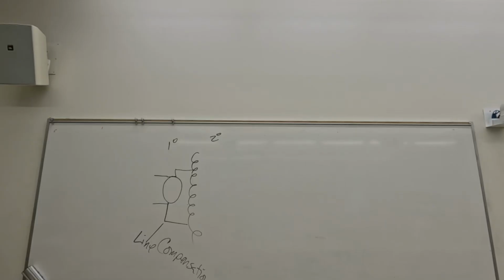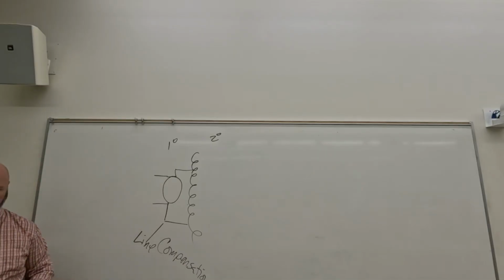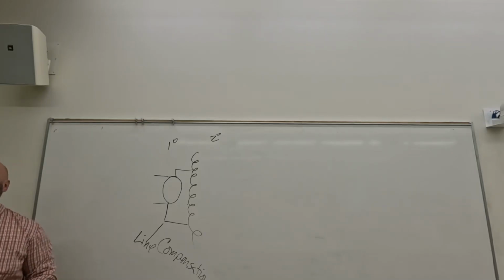All right. So the control panel, that's where we control everything. You've got your potential. What is your potential? kVp, right? kVp controls, in the x-ray beam, quality and penetration.